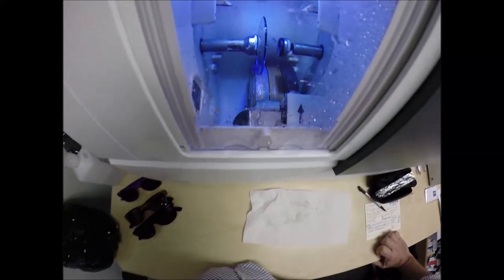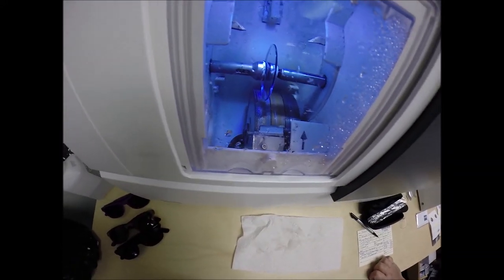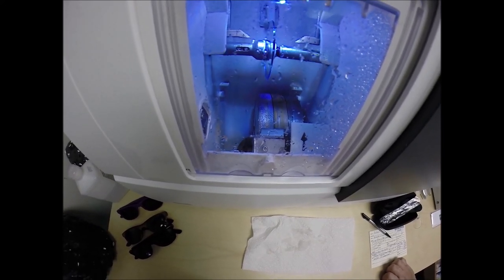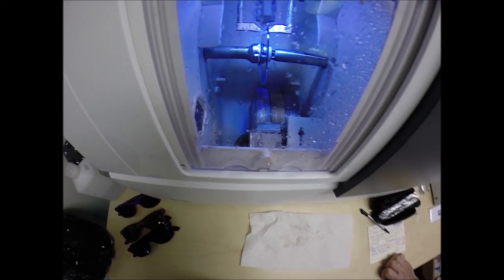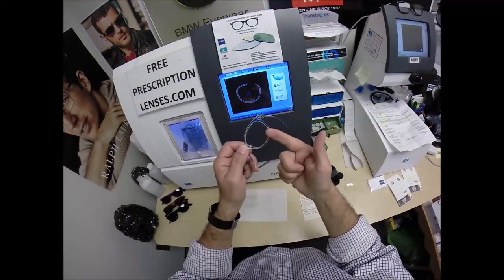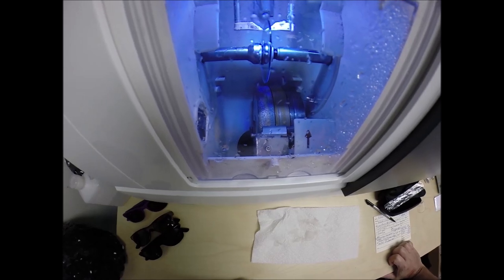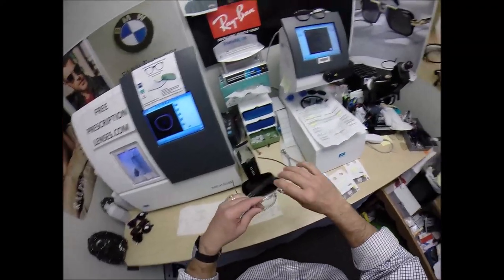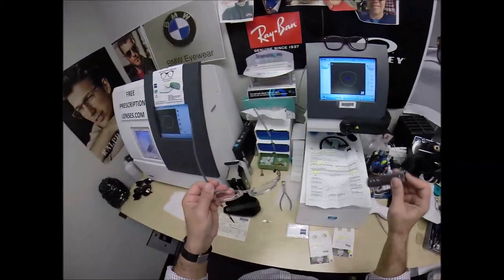The door closes. The clamp shuts just like before. And what do you know? The two white styluses are going to go around and make sure the lens is large enough to fit into the left side. And you can see as it's tracing the left side of the frame, first making sure it's large enough and then measuring the thickness to know where to place the bevel for the least amount of edge thickness.